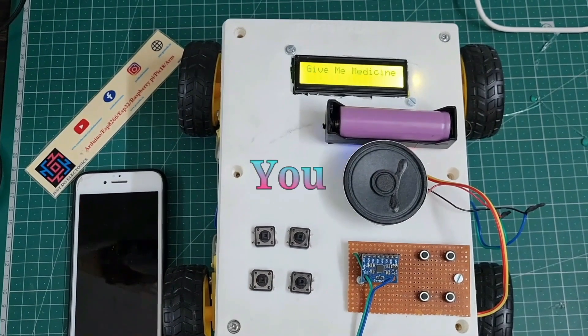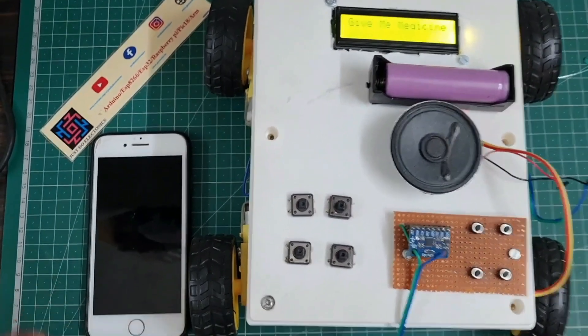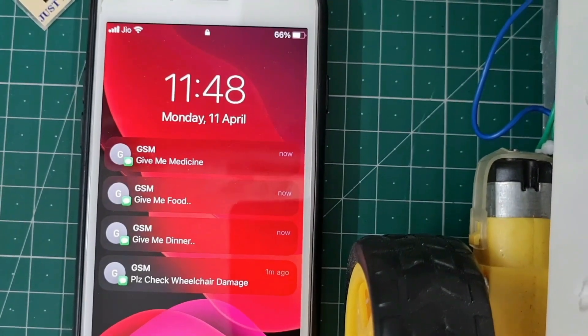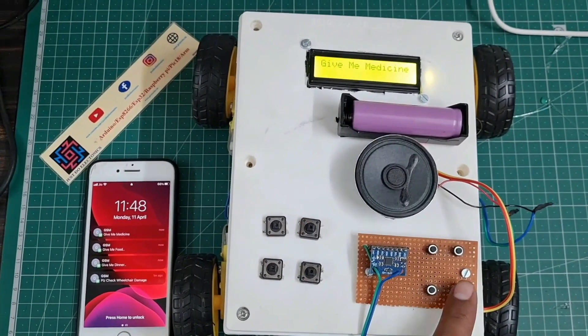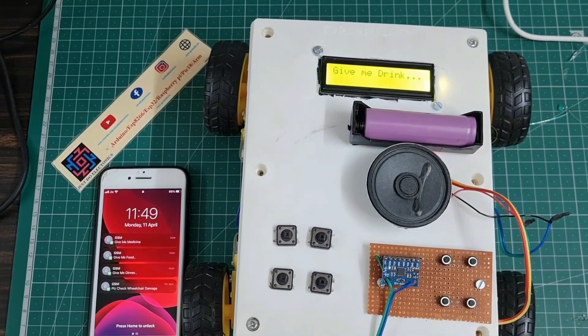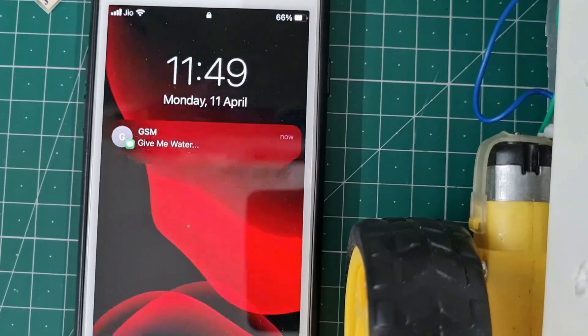When I press the third command button, the speaker says 'Can you please give me medicine' and the GSM sends the text message 'Give me medicine.' When I press the last command button, the speaker says 'Can you please give me a drink' and the GSM sends the text message 'Give me drink.'